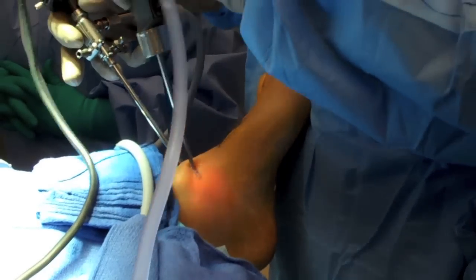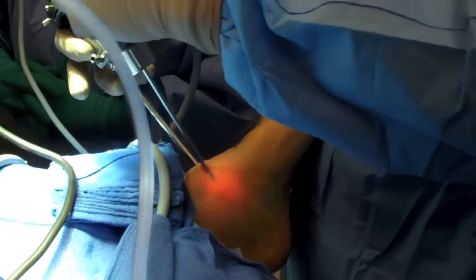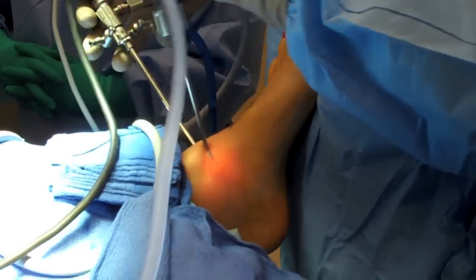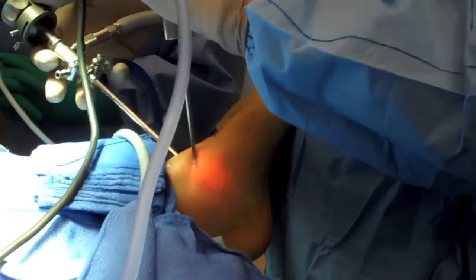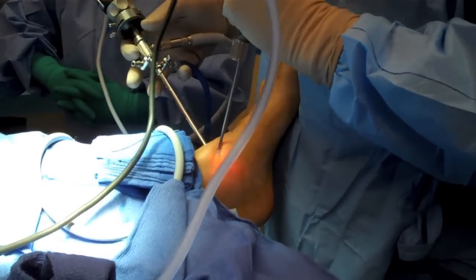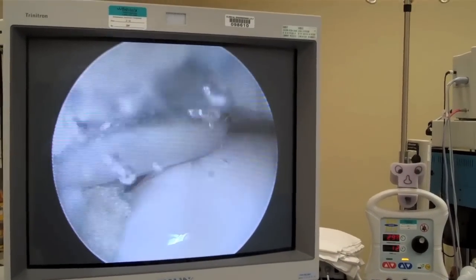You can see the sweeping type motion I am doing with the shaver. It is important to hold the camera steady and move with the shaver. Notice how I am holding the camera in arthroscopy with the video cord and ingress in a gun type grip. The light source is coming off the top of the scope. It is important with the orientation of the light source that you see the talus on the bottom and the tibia on the top.